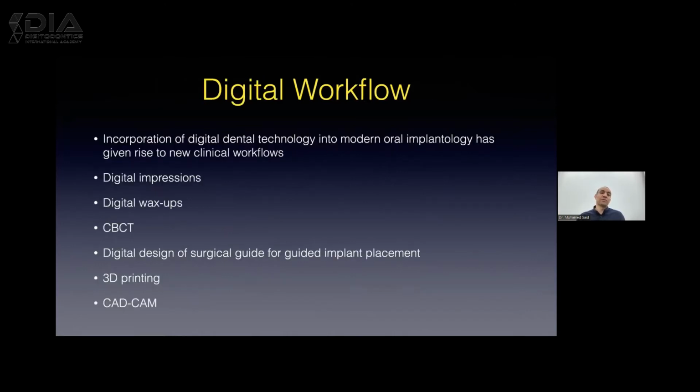But nowadays, the evolving digital technology has gone into modern oral implantology and gave us new clinical workflows. We can do digital impressions using intraoral scanners or extraoral scanners. When we have the data on the software, we can do digital wax-ups that don't take as long as the regular wax-ups that we spent hours on in the lab. We also have the option of doing a CBCT to get DICOM data for the patient's jaws.